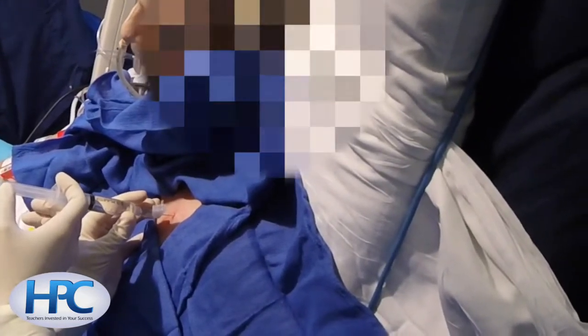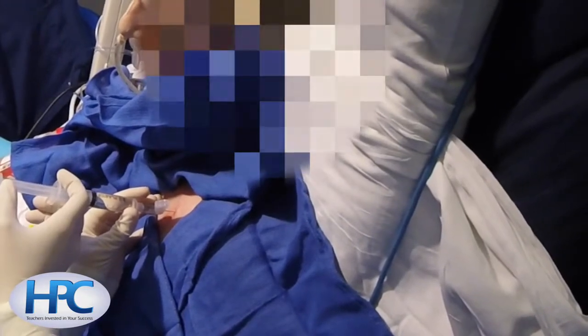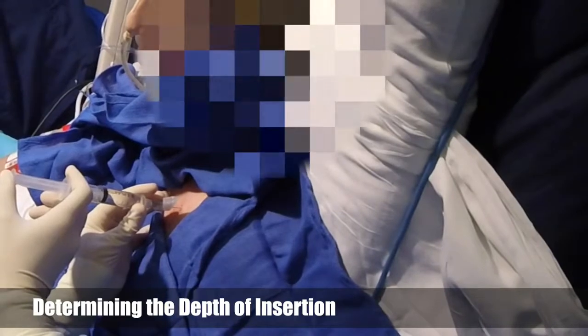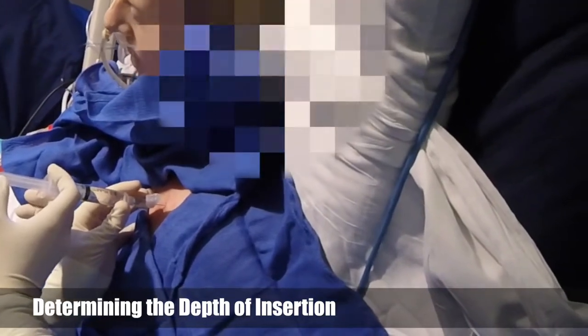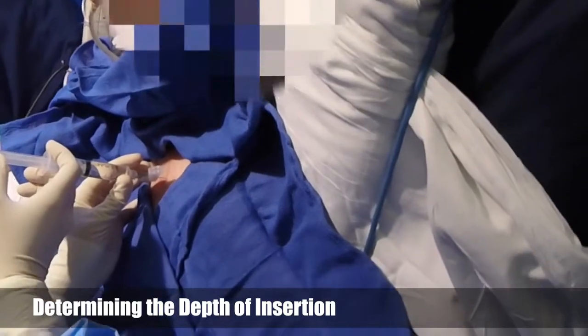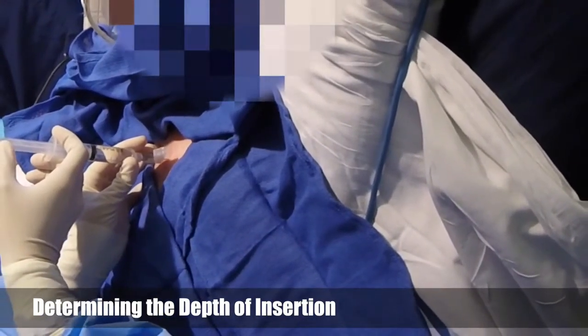Once we get a steady stream of bubbles, we know we're in the pleural space, and that is the appropriate depth of insertion of the pigtail catheter. When we advance the needle about 1/2 centimeter without getting bubbles, then we're administering more local anesthesia.